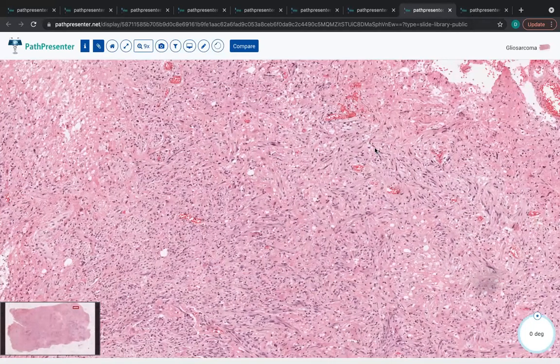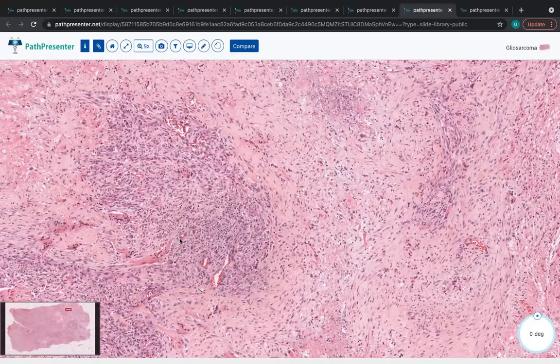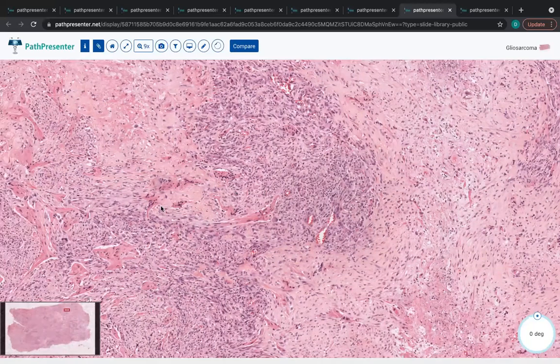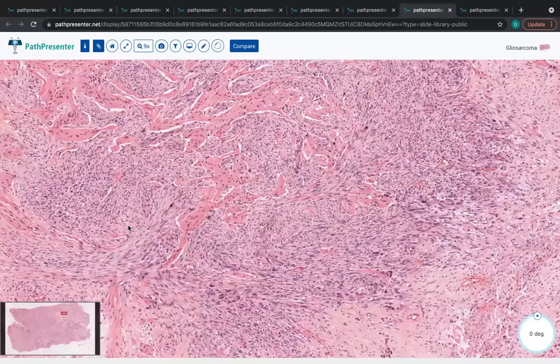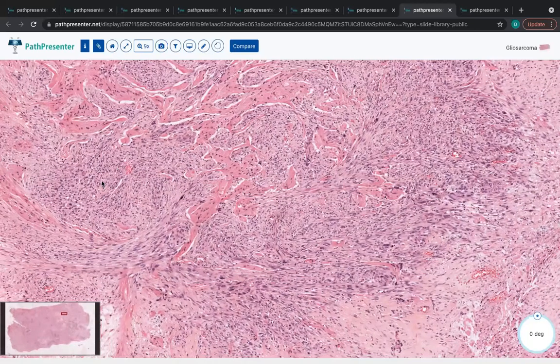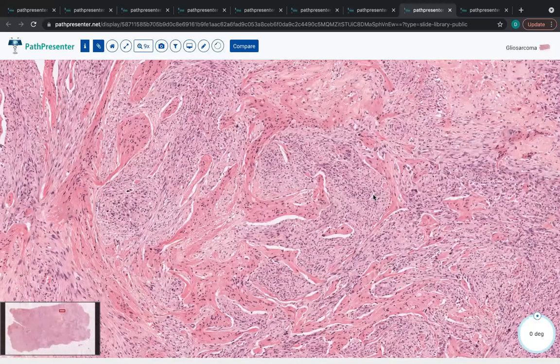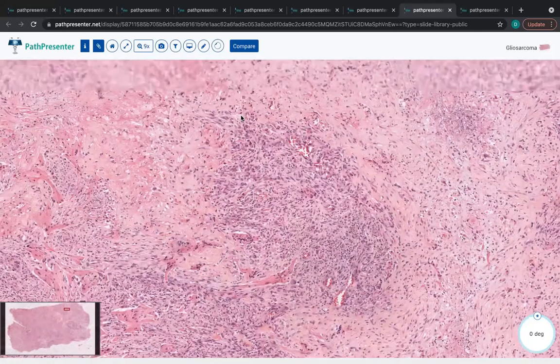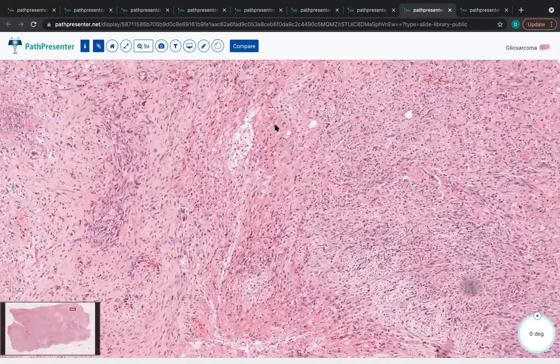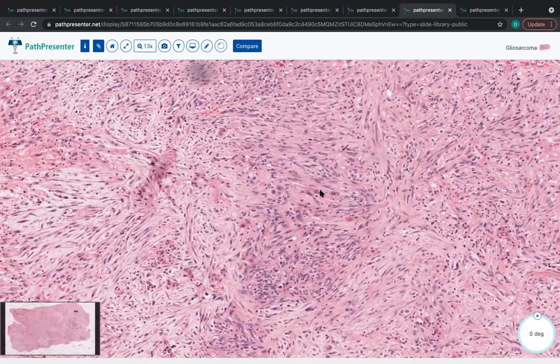So how common is gliosarcoma? They're fairly uncommon. One can see them from time to time, and some tumors that have some MAP kinase driver mutations, for example. I'm not sure why those tend to be more spindled in appearance than others, but overall, they're not terribly common. And those such as this one that have heterologous differentiation are fairly rare as well. But you can imagine if you're not given much clinical history and you just receive a biopsy such as this that's fairly small, it can be fairly challenging to sort it out.